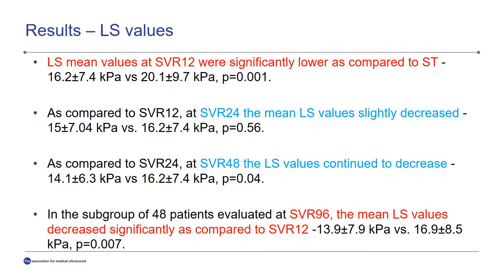What we obtain here is that the SVR12 values are significantly lower compared with the start of the treatment. From 20.1 kilopascals, the value became 16.2 kilopascals. This is highly significant. If we compare SVR12 with SVR24, 12 weeks later on, we can see a slight decrease from 16.2 to 15 kilopascals.